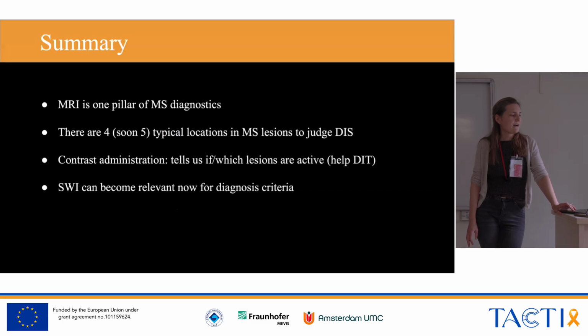In summary, MRI is one but very important pillar of MS diagnostics. Everyone who has a suspicion of MS will get an MRI scan for sure. And it's also a core pillar of follow-up of the patients. This is something we also have to talk about.